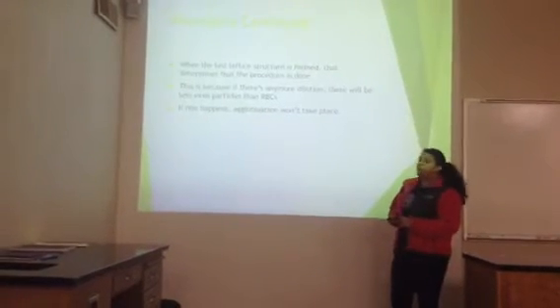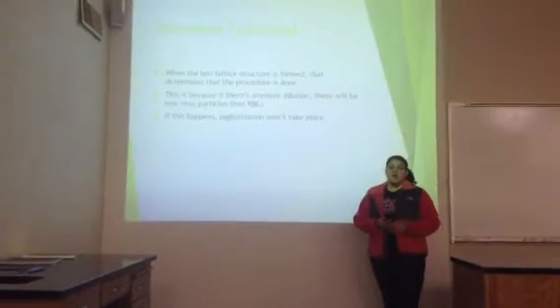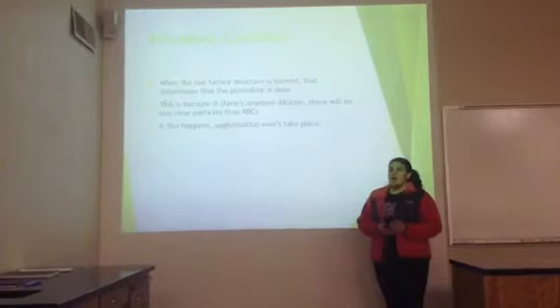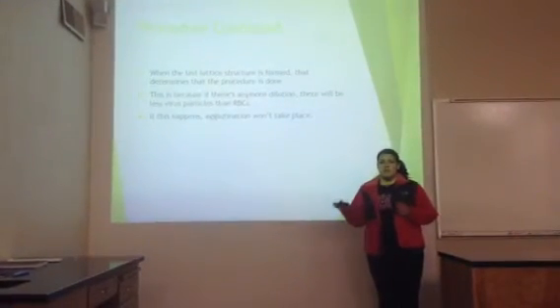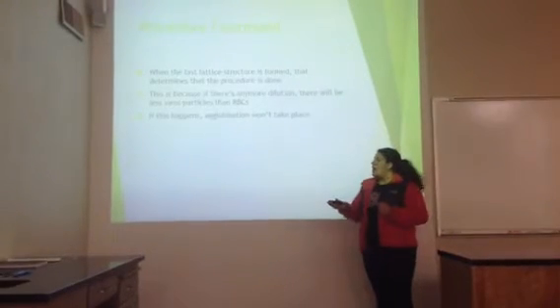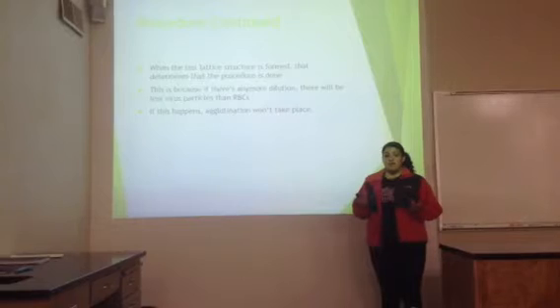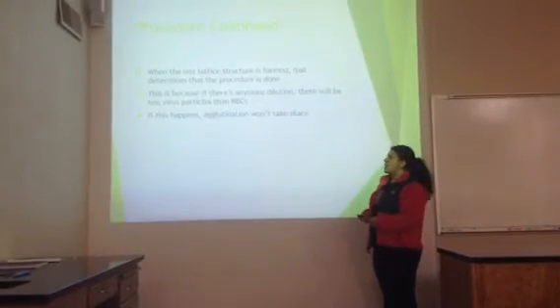When the lattice structure is formed, that's when you know to stop. If you keep running it and keep adding more dilution, you would get fewer viruses or bacteria compared to red blood cell dilution. If this happens, the agglutination won't take place, so sticking won't take place. You won't get an accurate reading of what's happening.